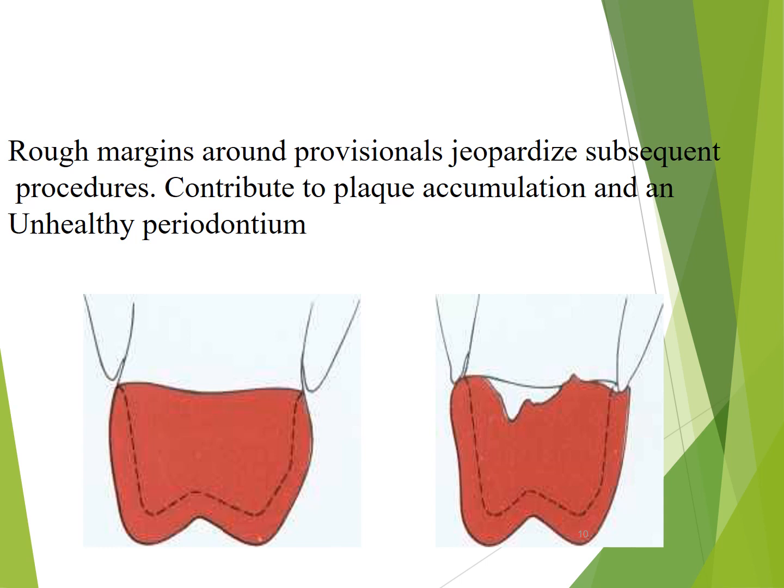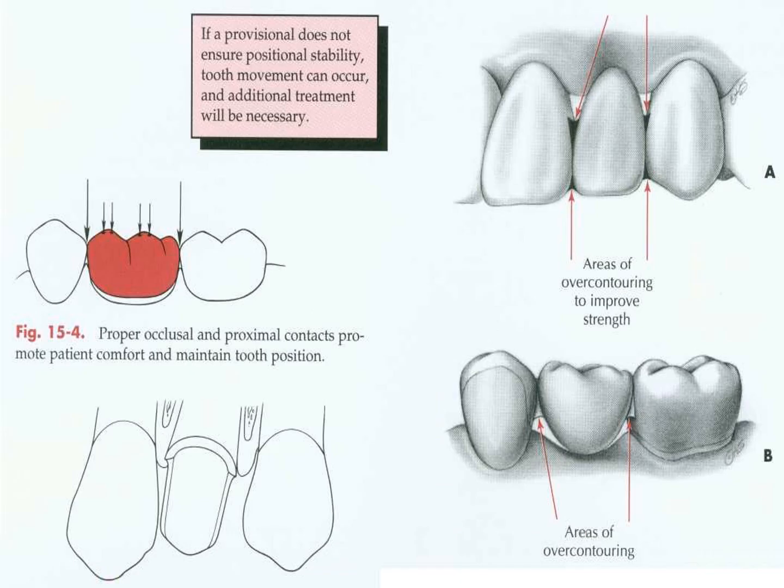As you can see in the photo, there are rough margins here. So it jeopardizes the procedure and also creates a problem for the tooth surface underneath. It will also contribute to plaque accumulation, and as a result there will be unhealthy periodontal tissue.